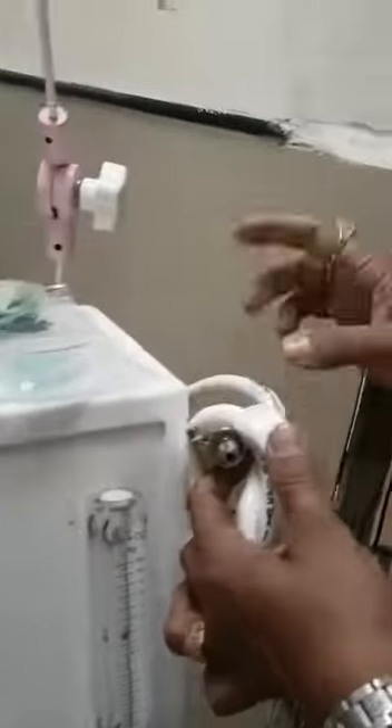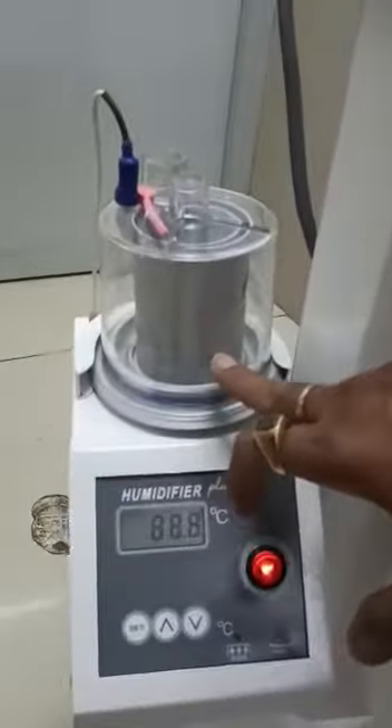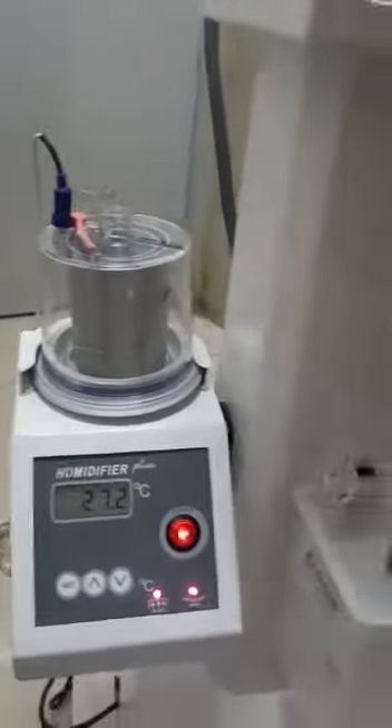You have to plug this key into your oxygen line. This is the humidifier — you have to fill water, regular water or distilled water, up till here. And this is the bubble bottle, where you have to fill the water till the mark.